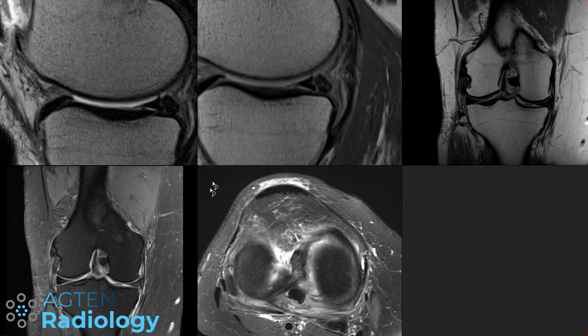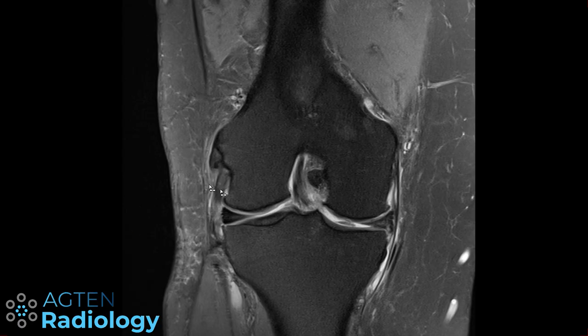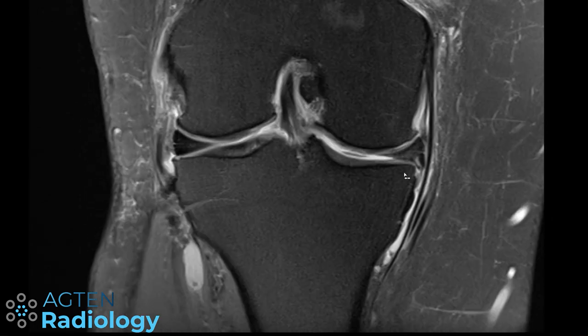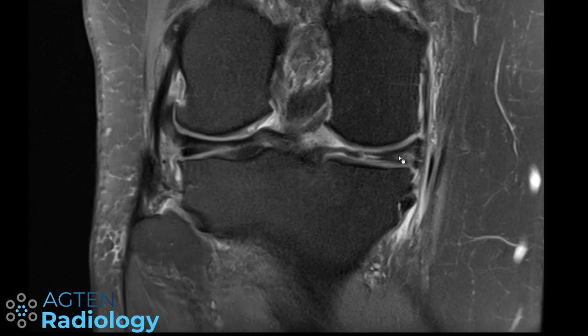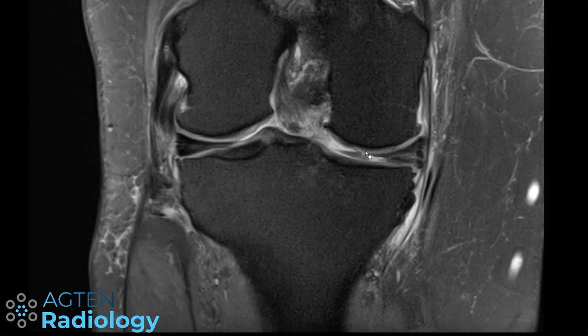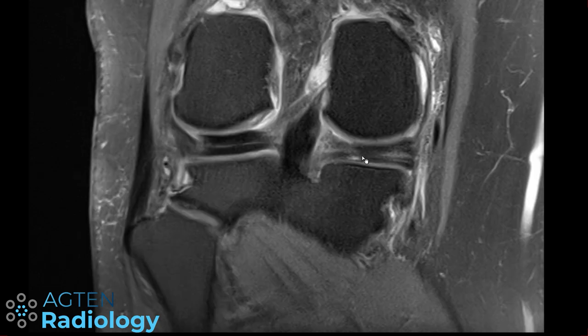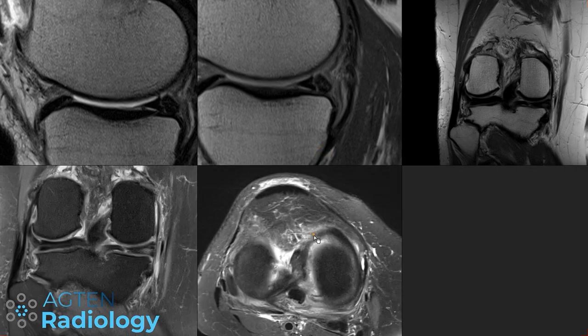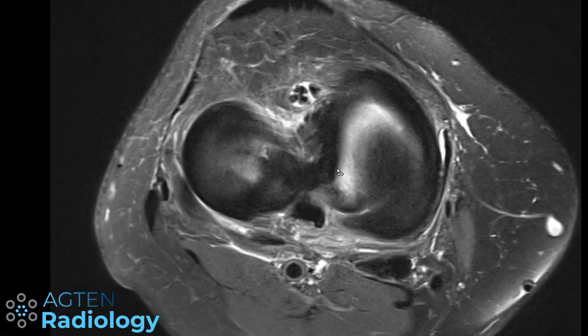And the best thing to do in such a case is to have a look at your other sequences. And again, here we have the meniscus. We follow it through. We can see a tear here. So here at this level, it's probably a radial component. And then we don't really see the tear. The root is okay. And the clue is then to have a look at your axials.